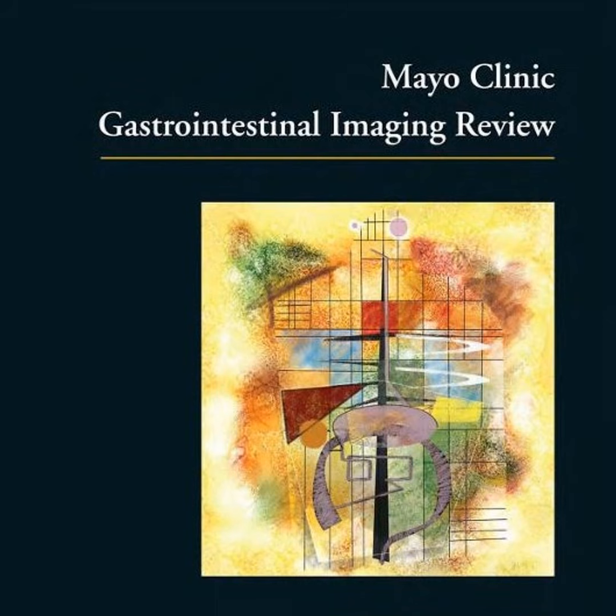And that level of diagnostic precision carries directly over to our evaluation of the pancreas, too. Oh, absolutely. Especially when analyzing genetic syndromes like von Hippel-Lindau disease. Right, VHL. The atlas notes that the classic abdominal presentation of VHL is a pancreas almost completely replaced by innumerable tiny cysts. But we have to understand the mechanism behind that replacement to really interpret the scan correctly. Yeah, von Hippel-Lindau is an autosomal dominant inherited disorder. It's caused by a mutation in the VHL tumor suppressor gene.